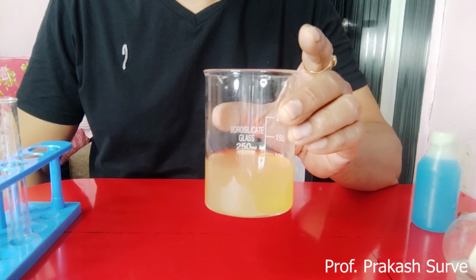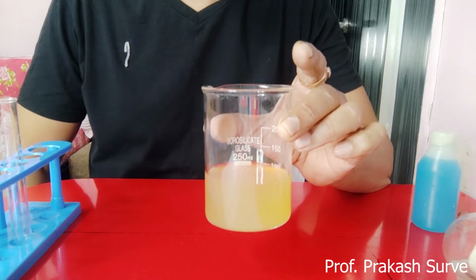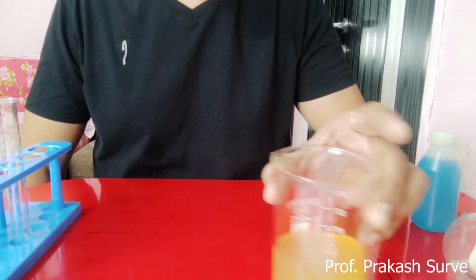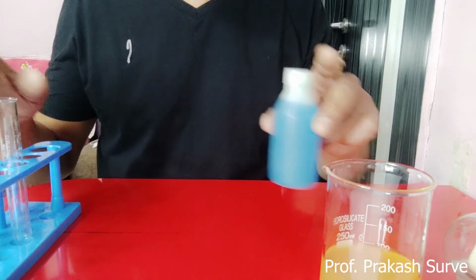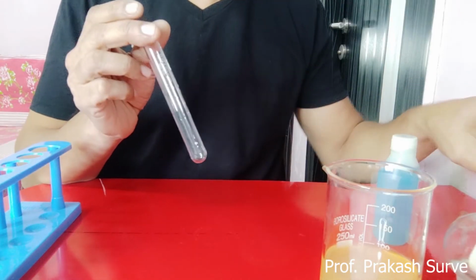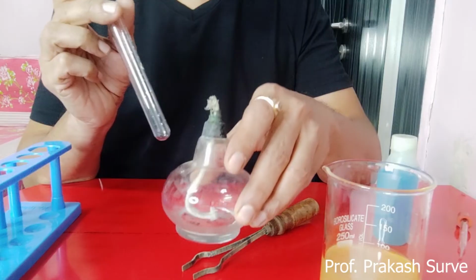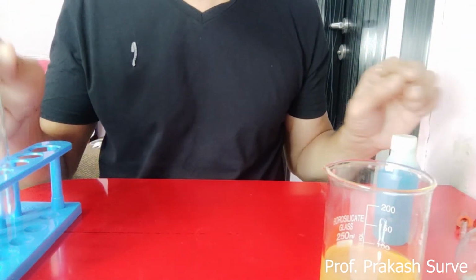Now we'll perform the test for sugar. Now this is the urine sample which is taken for checking the sugar level. Second, we require the Benedict reagent, and then the test tube holder as well as a spirit lamp. So these are the requirements for the test for sugar.